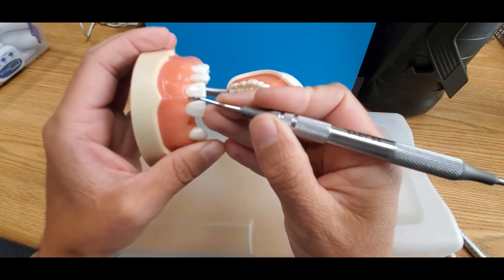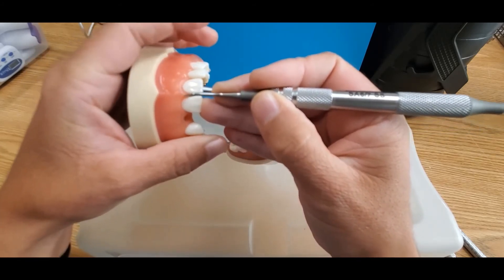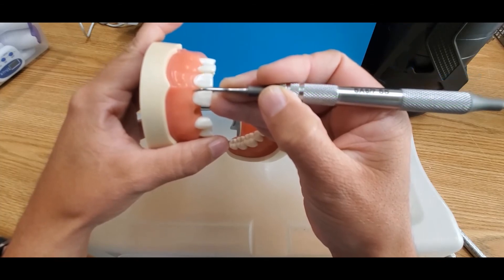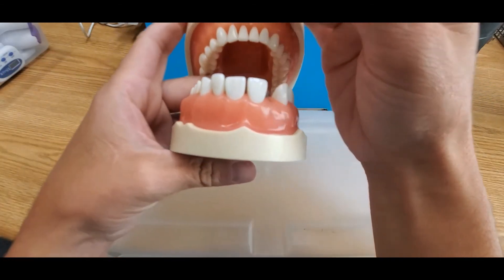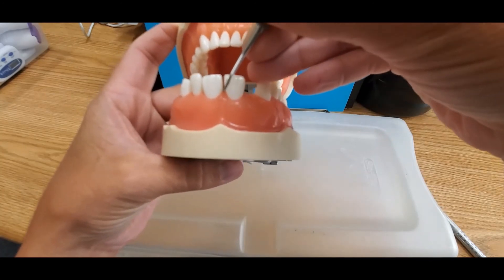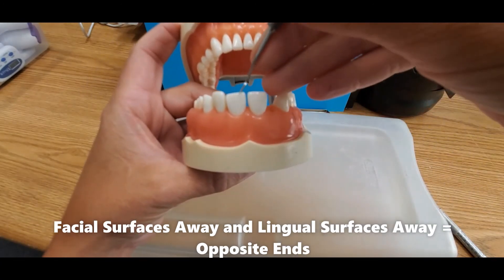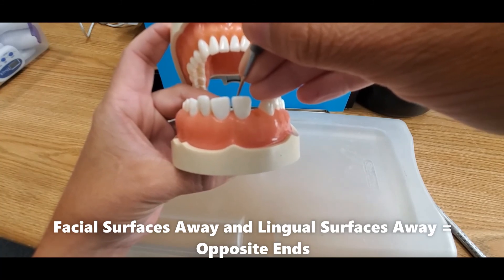If I hold the opposite end in the same place, again I have the terminal shank parallel to the long axis of the tooth, and I can see that the handle is pointing towards the mesial portion, or the away surface, of tooth number 8. This is the correct end for the away surfaces on the maxillary facial. I would come to 12 o'clock and use this end for this site. Once you've found the correct working end on the facials, you can stay in the same clock position, stay on the away surface, and flip ends to instrument the lingual — maxillary anterior surface away lingual.